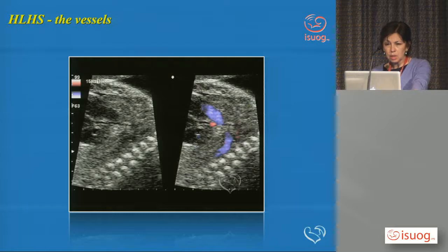So if you want to see that ascending aorta, and we do have to image that because it is one way of prognosticating for the Norwood procedure, this is where you would expect to see the aorta, and this is where you see the aorta, but you can see here is a minute vessel. I can't remember the measurement, this is about a centimeter here, so this is only about a millimeter or less in mid-gestation, 24, 25 weeks.